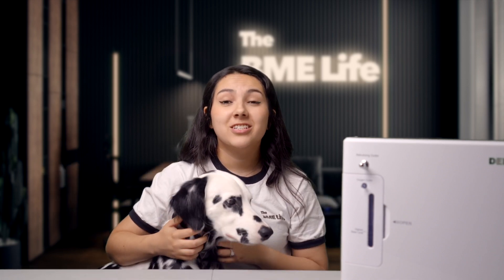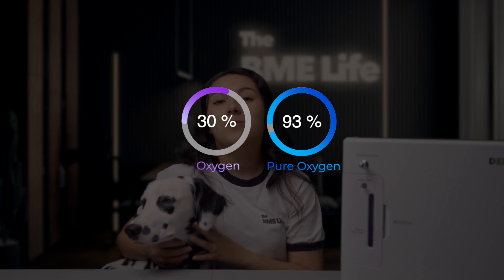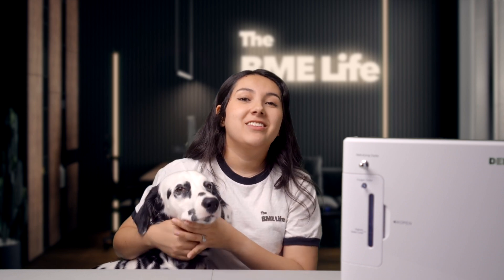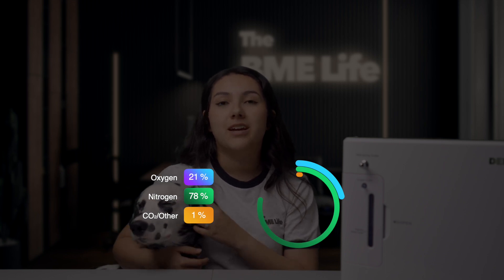This oxygen concentrator can be used to breathe in over 30% oxygen and up to 93% pure oxygen from the comfort of your own home. Just for comparison, the air that we normally breathe is about 21% oxygen and 78% nitrogen.